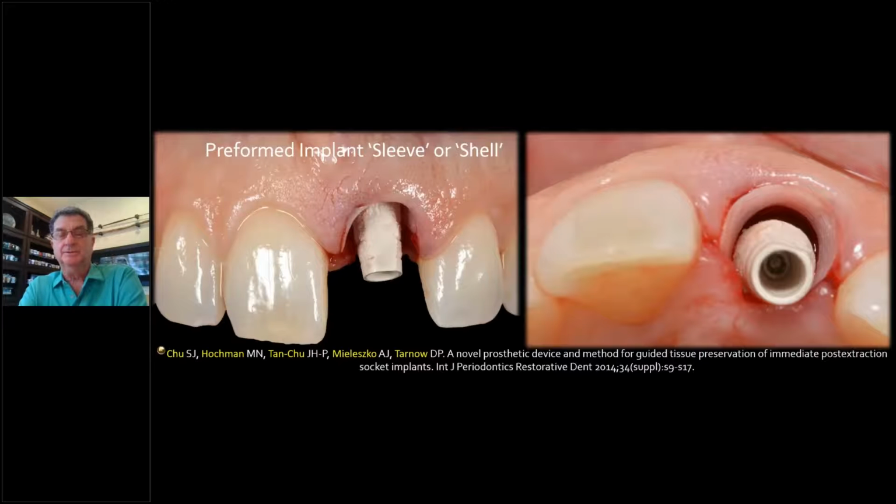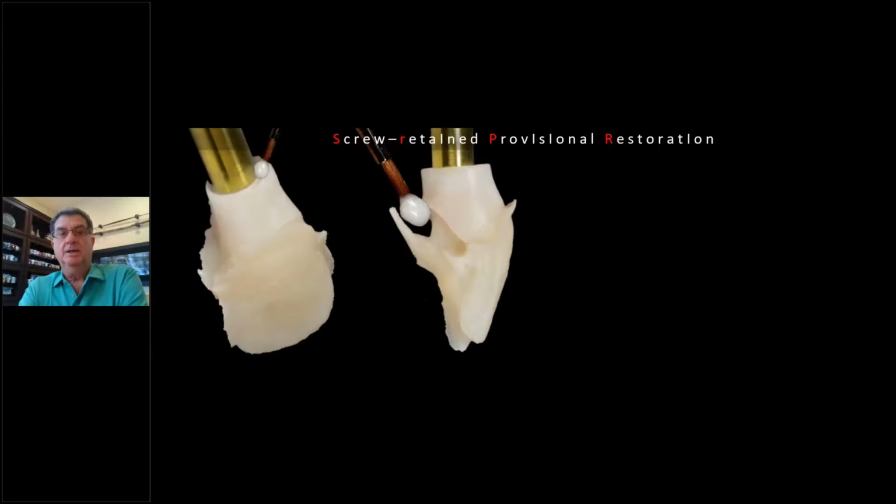And it goes in like this. Now it keeps the tissue from collapsing. See the opening? Now you can make your temporary. You can add some acrylic. You have your temporary shell made already, and then combine the shell to this and then fill in the voids. Take it out of the mouth.